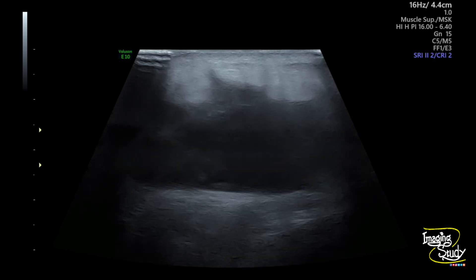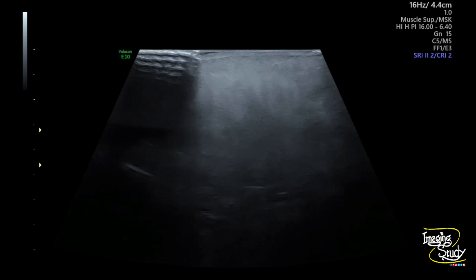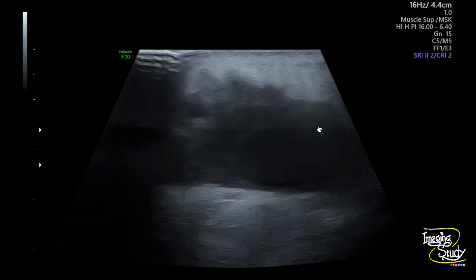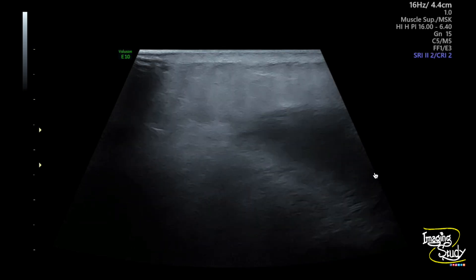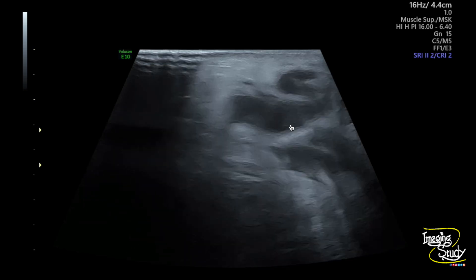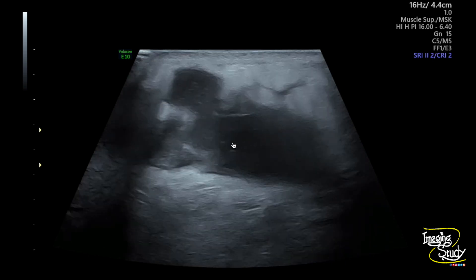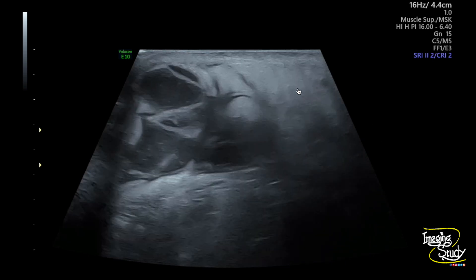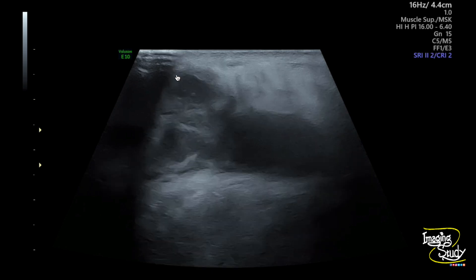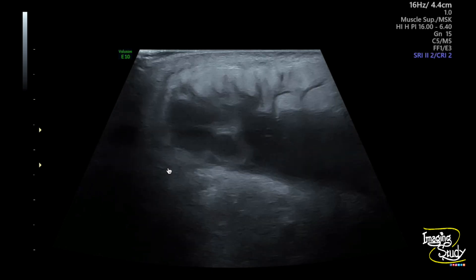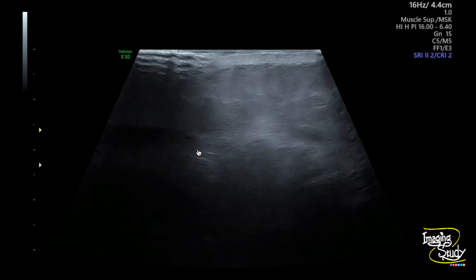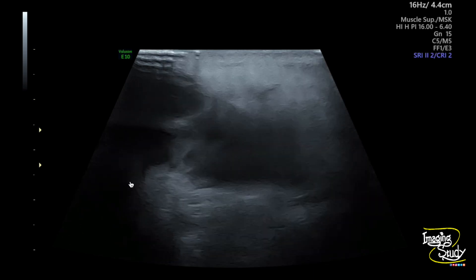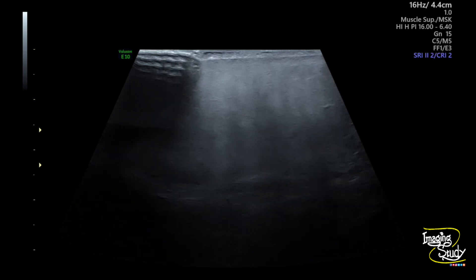Here you can see the high-frequency ultrasound of the lateral arm. You can see an irregular heterogeneous collection which is showing internal low-level echoes located superficially. You can see the surrounding subcutaneous tissue is edematous. This irregular hazy collection with surrounding subcutaneous tissue edema indicates abscess.